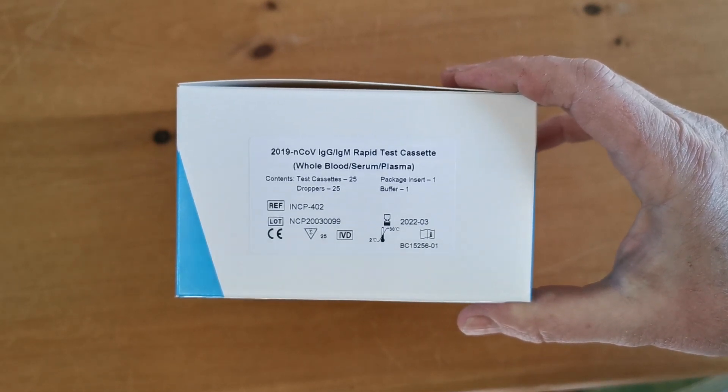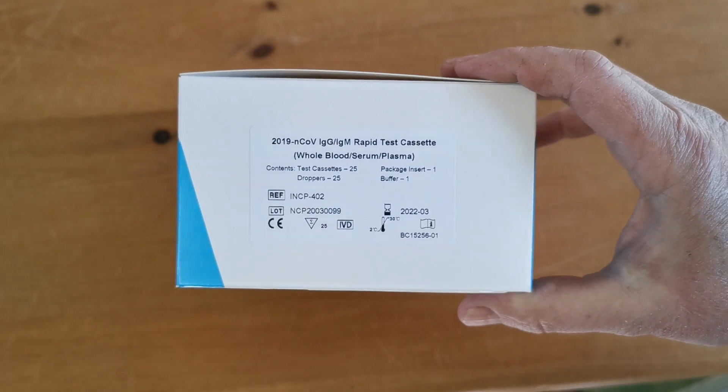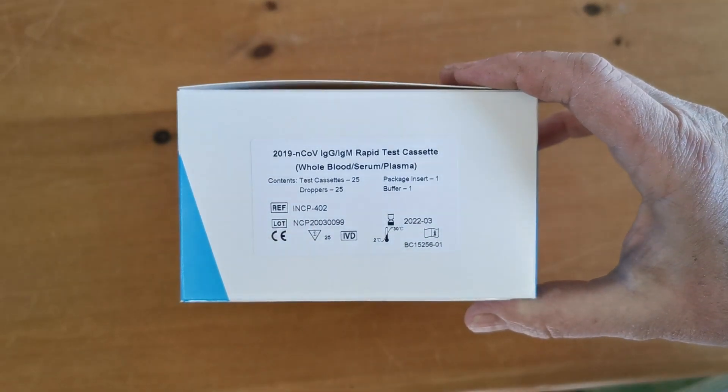The pack contents is 25 foil-wrapped test cassettes, 25 dropper pipettes, one pack insert, and one pack of buffer. The catalogue reference code shown here is INCP 402.